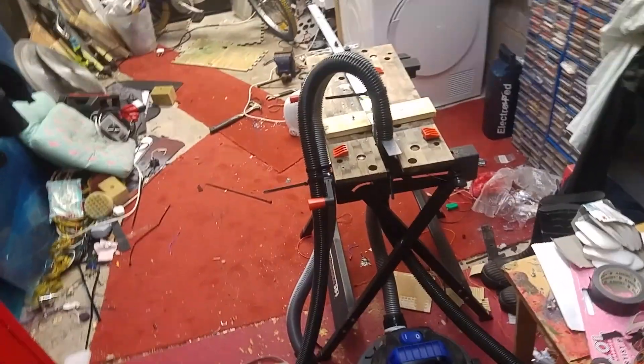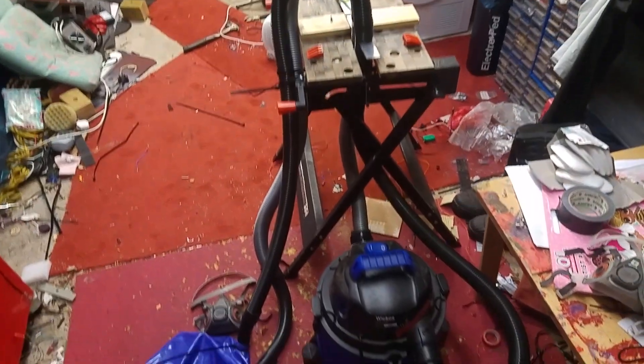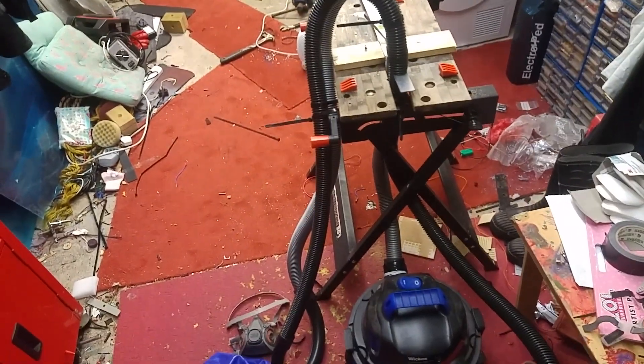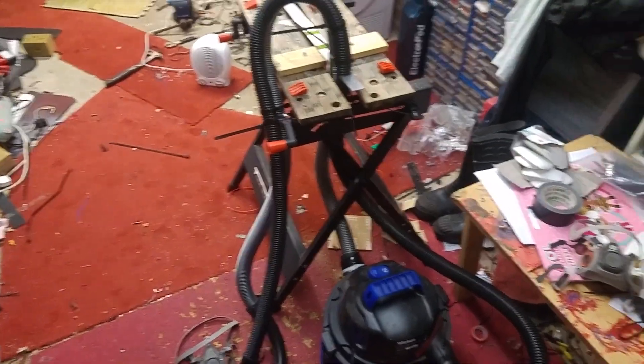Coronavirus has happened and we don't have enough ventilators. At its simplest, a ventilator is just a way to inflate and deflate the lungs of a patient who can't do it themselves. So I've made this in my garage in a day, just as a project.